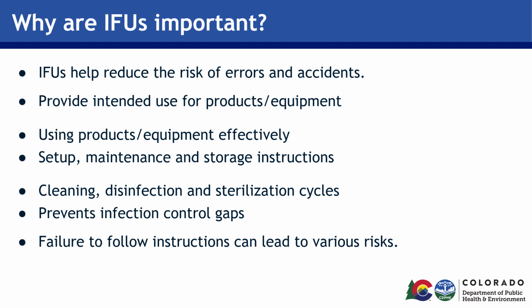In many healthcare settings, the most commonly violated manufacturer's instructions for use are those related to cleaning, disinfection, and sterilization of reusable medical equipment. IFUs break down how products should be set up, proper maintenance, as well as how to store them properly when they are not in use. To go along with maintenance, especially for medical equipment, IFUs will include directions on how to clean, disinfect, and sterilize items effectively to prevent infection control gaps.